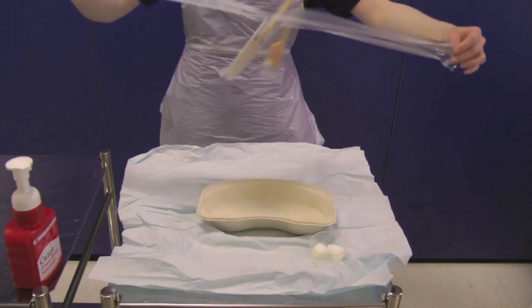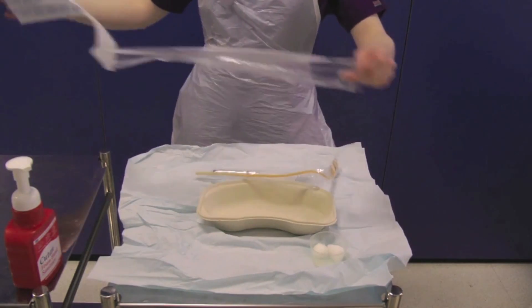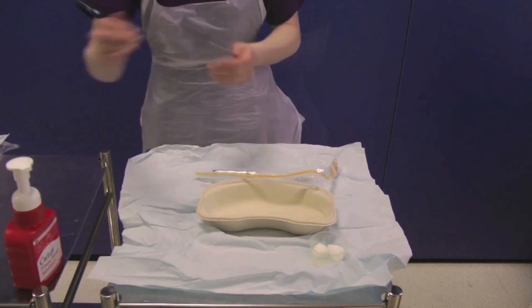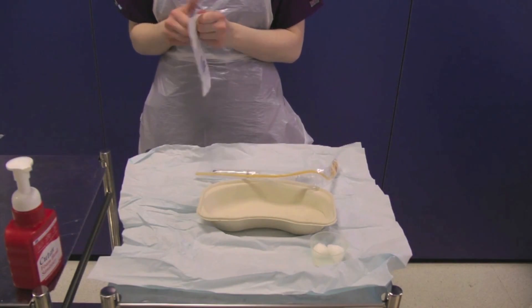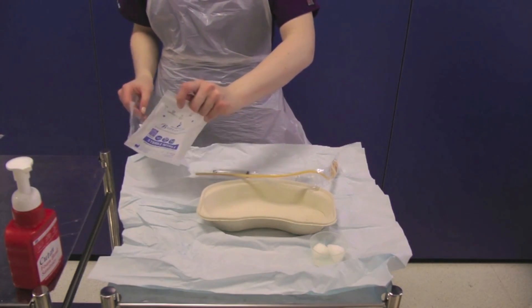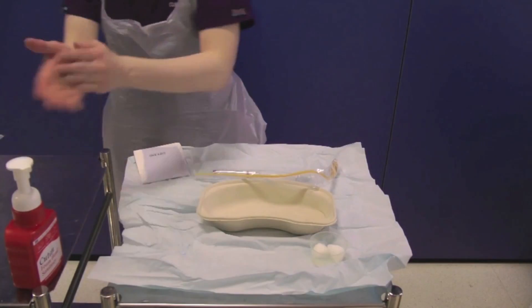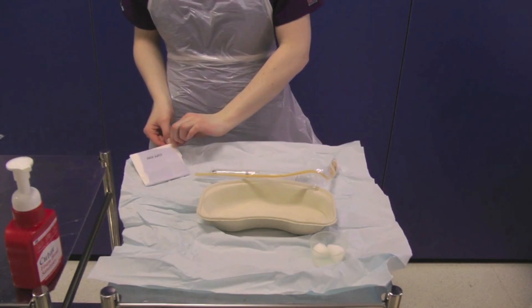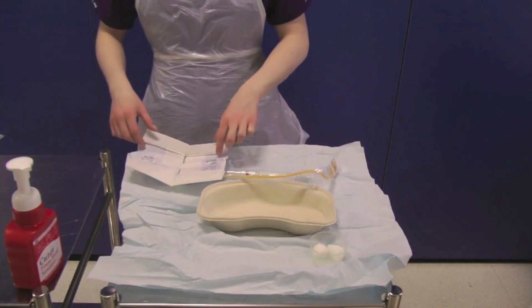Open the outer packaging and carefully drop the catheter and syringe onto the sterile field, being very careful not to touch the sterile field with the non-sterile outer catheter packaging. Take a pair of sterile gloves and drop the internal packet onto the sterile field. You must decontaminate your hands at this point, then carefully open the sterile wrapping, ensuring you do not touch the sterile field, and put the gloves on.